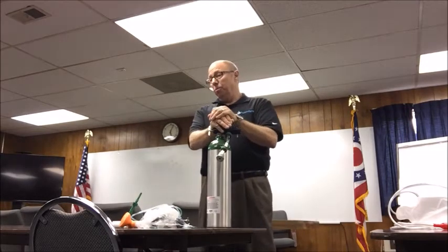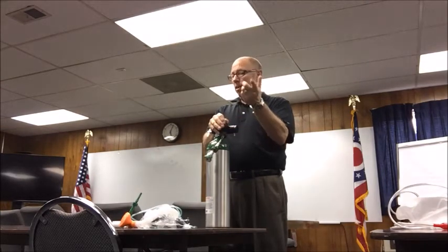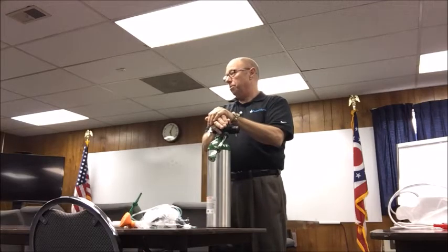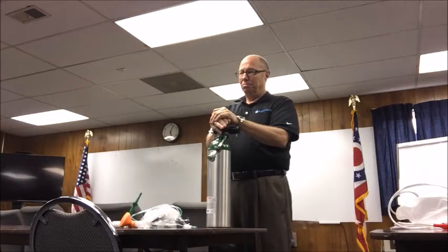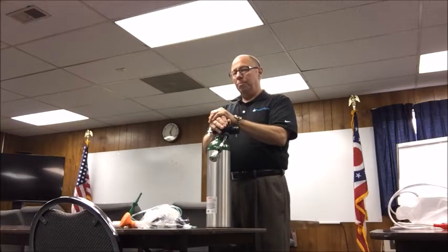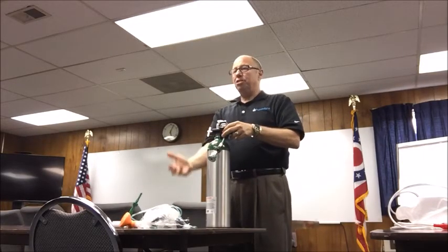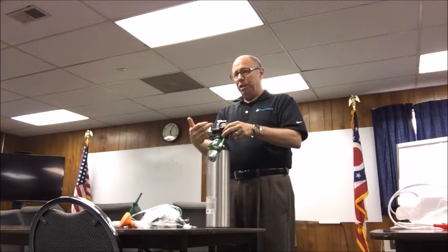Like the Emergent, we use the high pressure side. Does anybody know why we use the high pressure side? Why every ventilator in the hospital, every anesthesia machine, Emergent, all the capital CPAP equipment uses the high pressure side, and we don't use the Christmas tree? The reason is that flow is unrestricted. That is nothing more than a check valve, and when I press that check valve in, I get constant flow out of the tank. I'll drain that tank within 5 minutes if I just hold that check valve in.